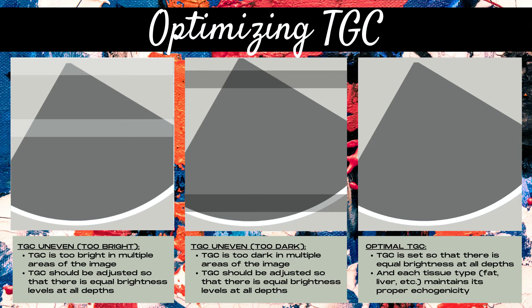One of the most common ways to improve an image is ensuring that when imaging an organ, such as the spleen or the kidney, that organ has equal brightness levels throughout. It's very common for the top part of the spleen to be darker than the rest, so bumping the TGC control up at that depth level will give the spleen nice, even brightness levels throughout.